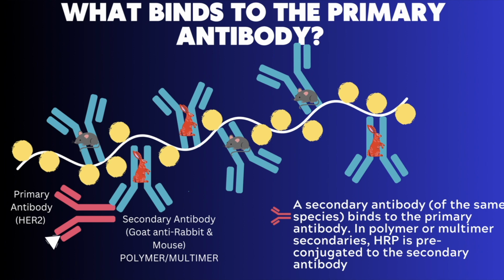In this example, I will start here with this blue antibody. Some of you may be looking at this shape and thinking, hey, why does that look exactly like the HER2 antibody? Well, that's because this is also an antibody. However, secondary antibodies are much more vague than primary antibodies. These little blue secondary antibodies will bind to any mouse IgG and rabbit IgG.